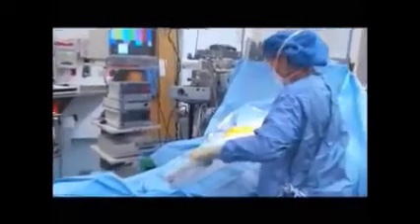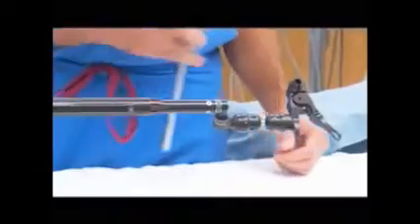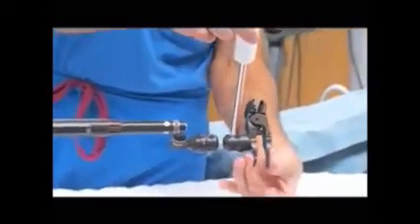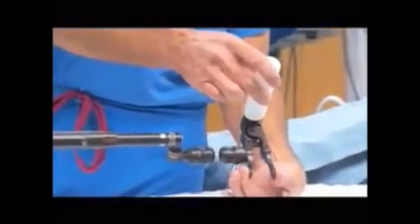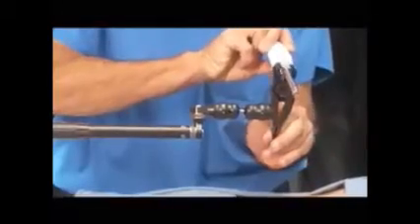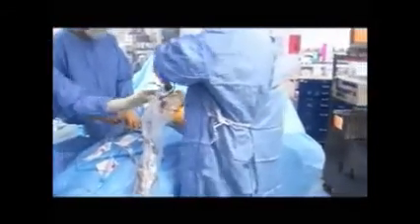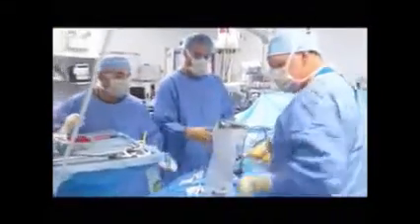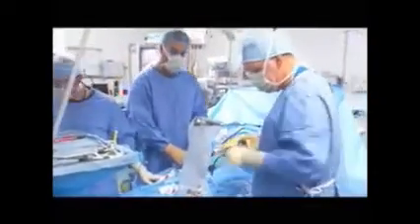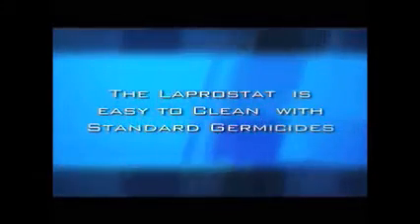If you have any questions regarding setup of the laparostat, please contact your CivCo rep. The laparostat connects to instruments by squeezing the ends of the clamp and guiding the instrument into the appropriate slot of the open jaws. The laparostat may be quickly disconnected and reconnected as needed, and can be disengaged at any time and quickly folded out of the surgical field. Between procedures, the laparostat requires very little maintenance and can be wiped down with germicides if necessary.